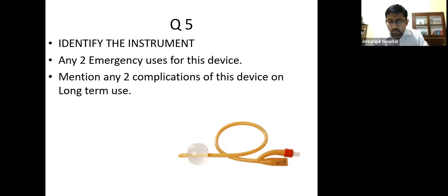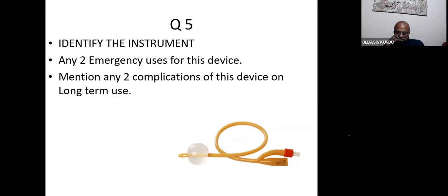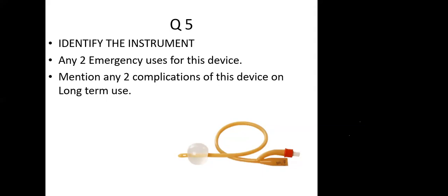Sir, cholecystostomy. Cholecystostomy is a good answer, sir. Any other GI uses? Feeding jejunostomy, sir. It can be a feeding gastrostomy. Okay. Anything in the jejunum? Feeding jejunostomy, sir. Very good. Right. Now see how many uses you are saying now. Anything in the cecum? Sir, cecostomy.